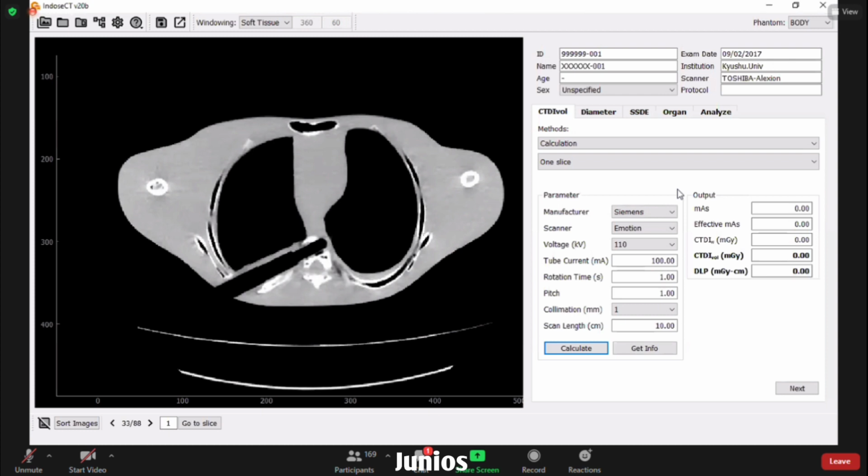It's like this. We have already known that the picture must be in DICOM format. But if you have no key, like a password, to extract the images in the DICOM, because there are some systems that can't extract in the DICOM, can you change or replace it with JPG or PDF format, sir?